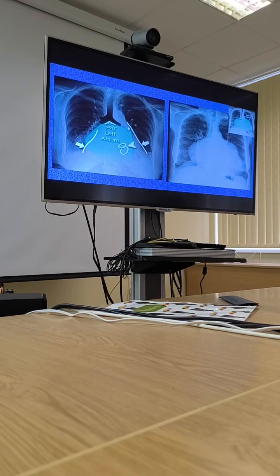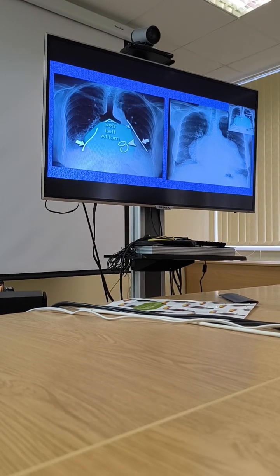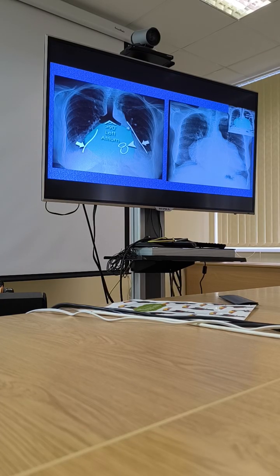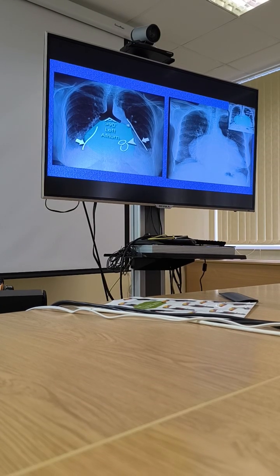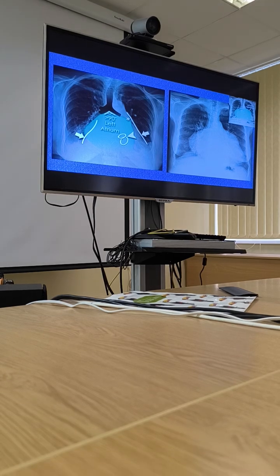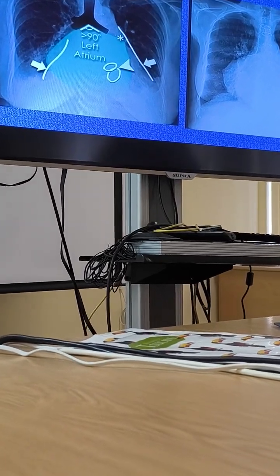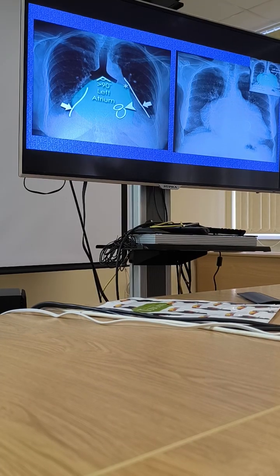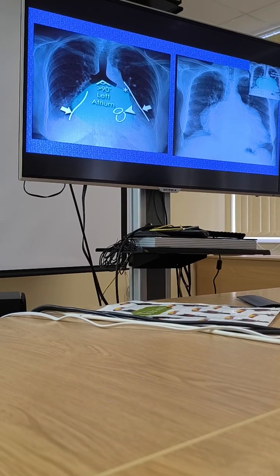If you want, you can look a little bit deeper; again, inside the notes section there is a more detailed description. My idea is that we are not doing the full diagnostic work, but if we see something representative through the shape of the heart, we make some conclusions and some recommendations.